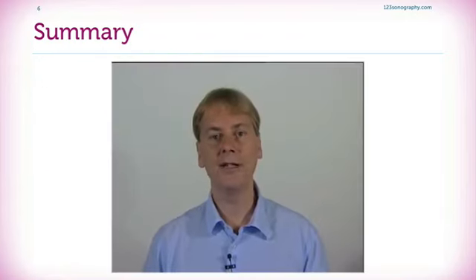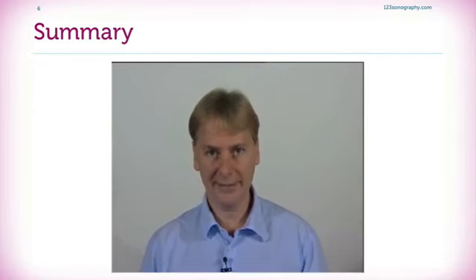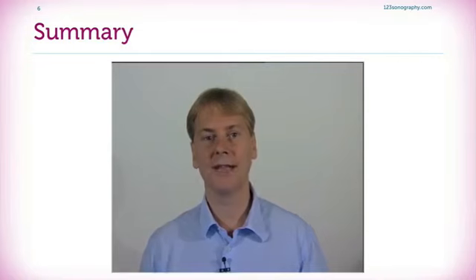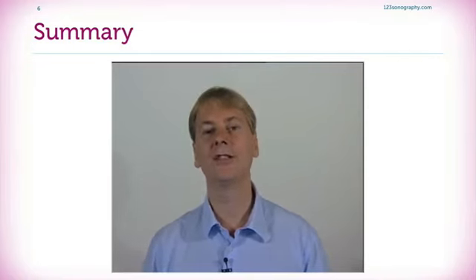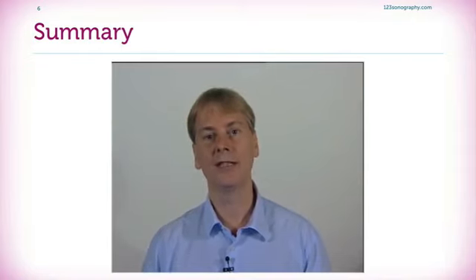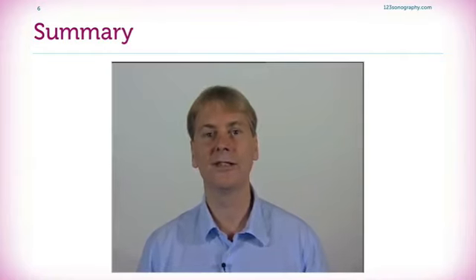So if you want to see more examples of patients with aortic regurgitation, please go to the Atlas section of our platform. There you will find numerous different examples of patients with different degrees of regurgitation and different etiologies. As we pass along with this course, you will note that you will encounter aortic regurgitation quite frequently because, as you know, aortic regurgitation is a frequent finding.